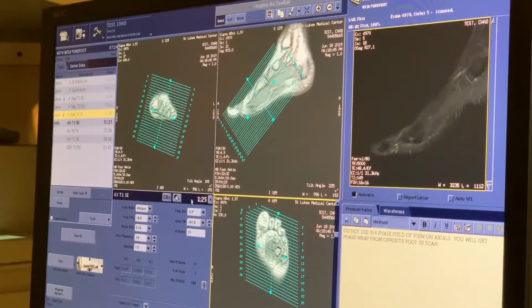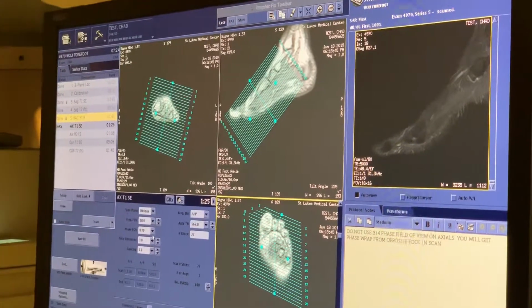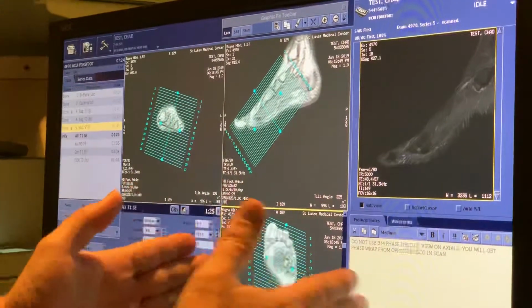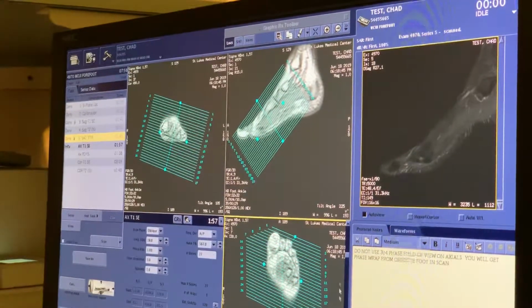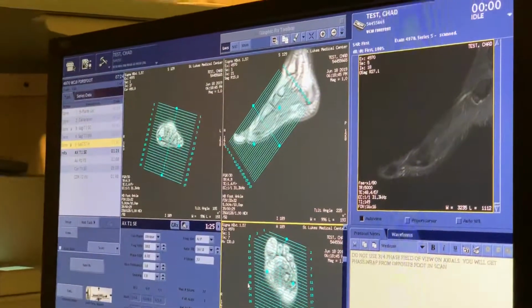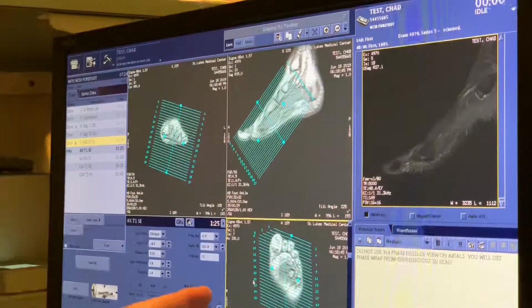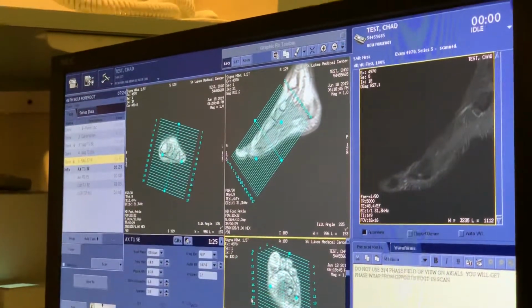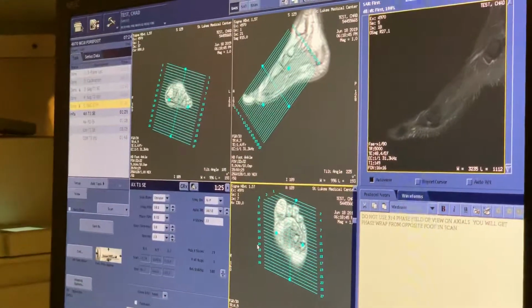I'm happy with that. One other thing here is that we've got a 0.7 phase field of view, which means that it's been brought in a little bit. This is the way the scan would normally be. You bring it into 0.7 phase field of view, that shortens your scan time, right? The only issue is that sometimes the other foot will wrap if you do that, because it's wrapping this way. So if you have a foot that's sitting over here, it might wrap over the anatomy. So it's a risk you take if you do that.